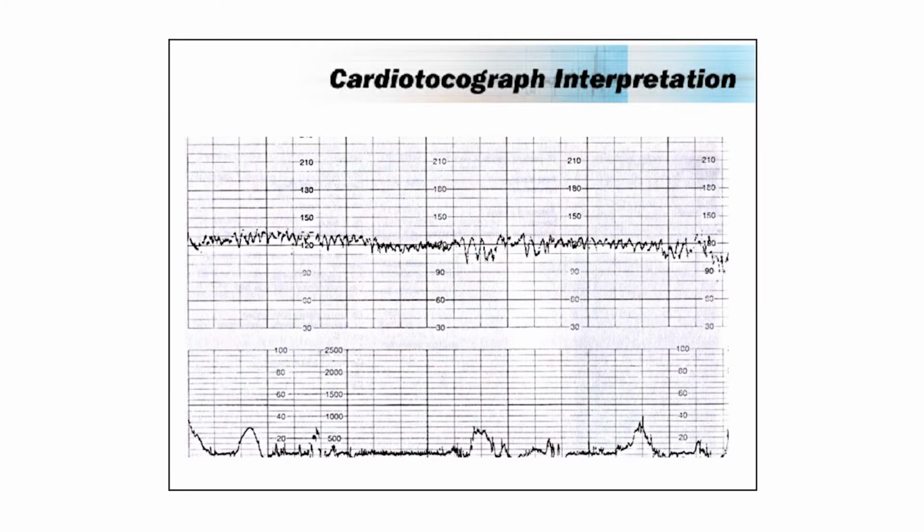So here's an example. In this particular case, the midwife wrote down in a hospital I worked in, query sinusoidal tracing. Now, those of you who are around labour wards a while will probably disagree that this is sinusoidal. It's not sinusoidal. It's too sharp, and I would agree it's not sinusoidal. But I understand any clinician writing down query sinusoidal and getting a second opinion on it.